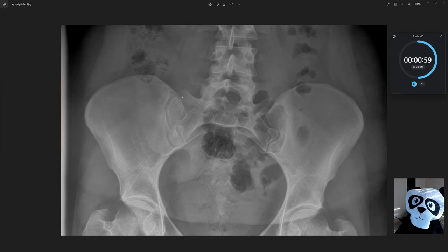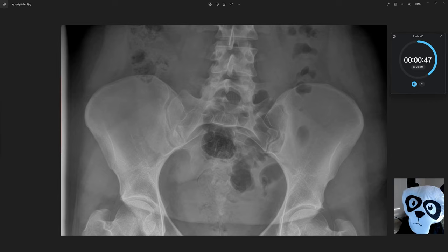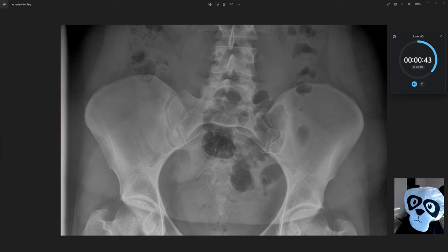The bilateral sacroiliac joints are approximated. The iliac wings show no focal lesions or fracture identified. The bilateral hips are also approximated with minimal degenerative changes involving the femoracetabular joints.